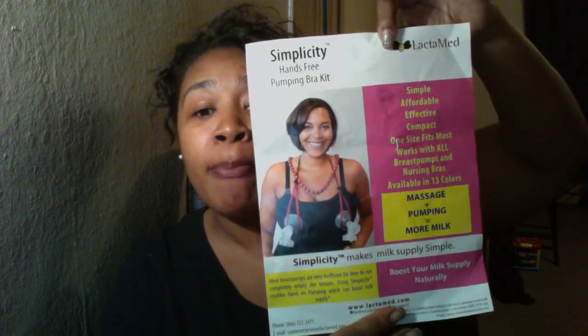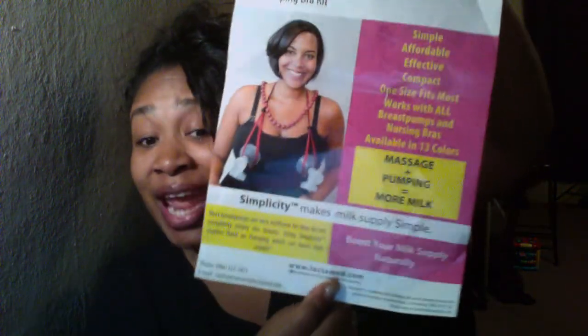Simplicity makes milk supply simple. Most breast pumps are very inefficient — they do not completely empty the breasts. Using Simplicity enables hands-on pumping, which can boost milk supply naturally. So if you're a breastfeeding mom out there who pumps and wants to boost your milk supply, this is definitely the product for you.